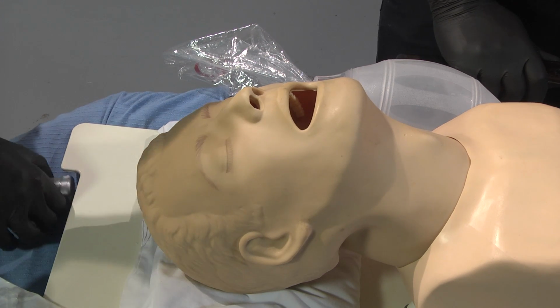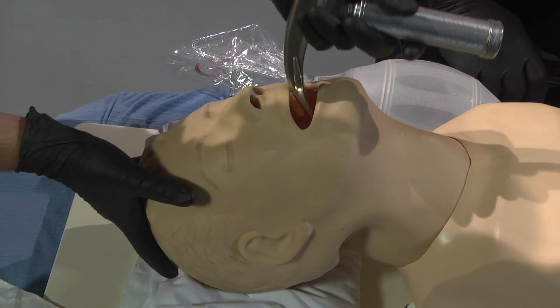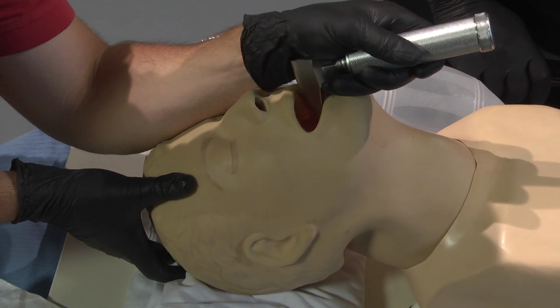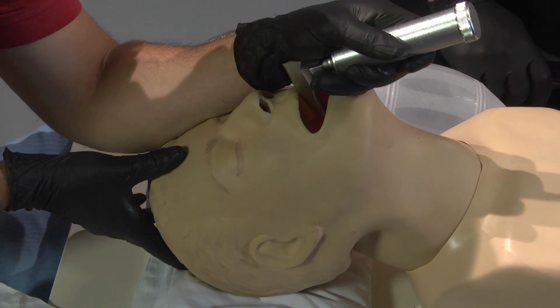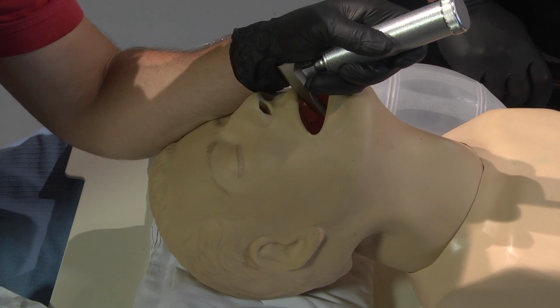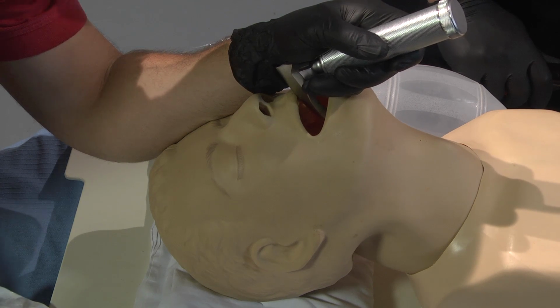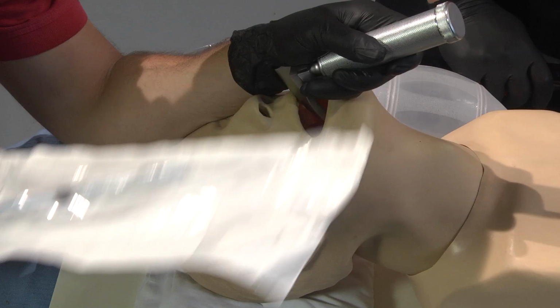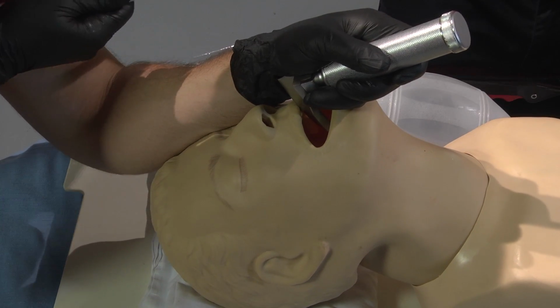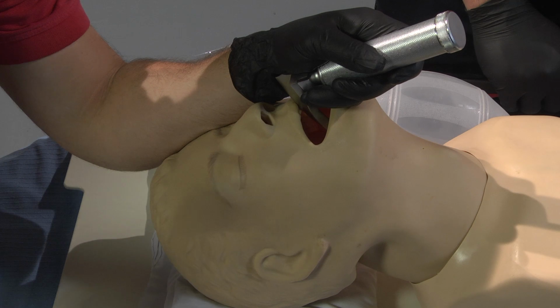Insert the laryngoscope to the appropriate depth for the specific blade. Miller or straight blades will elevate the epiglottis directly, while the Mac or curved blade should be guided posteriorly down the tongue with the distal tip of the blade being placed in the vallecula. Upon insertion of blade, sweep the tongue to displace and elevate the mandible. The EMSP should take great care not to rock the blade or use the teeth as a fulcrum.